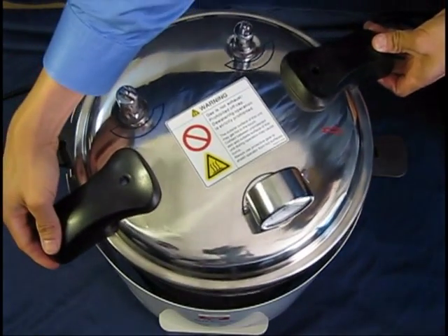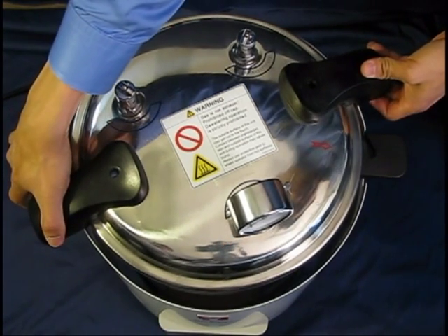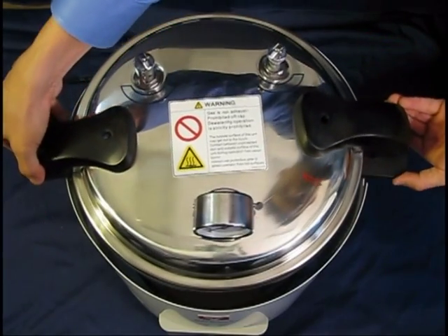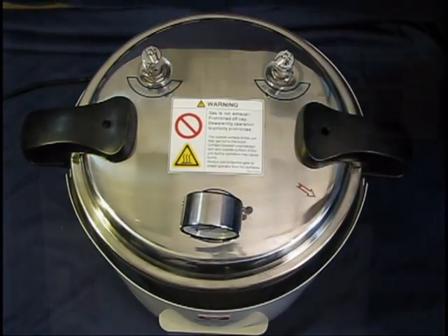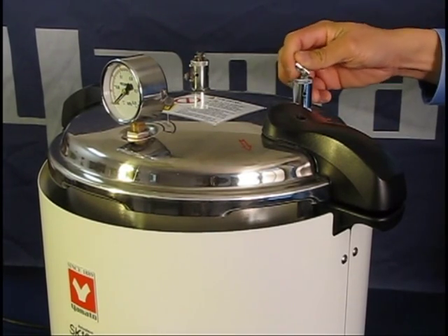When placing the lid, align the red arrow with the right handle. Press down and twist the lid clockwise into position. Make sure both the exhaust and safety valves are closed.